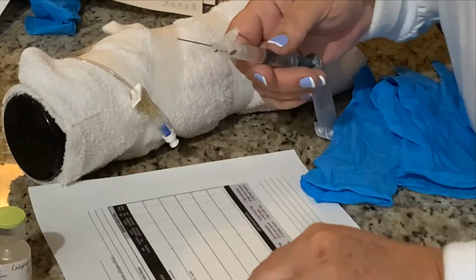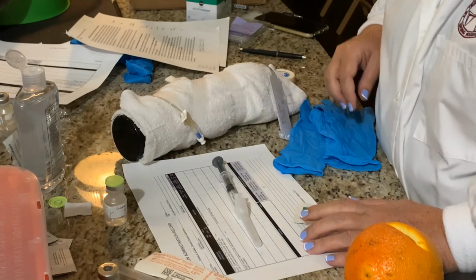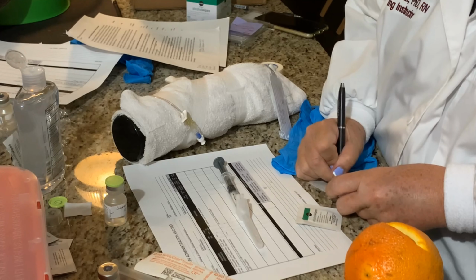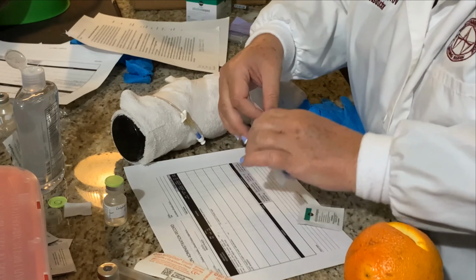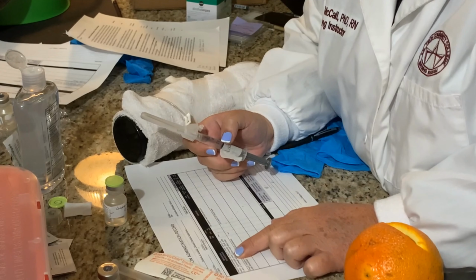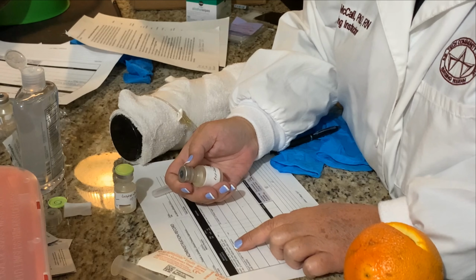Pull that out. Again, I'm going to do the one-handed scoop method. I don't want to contaminate anything. The next thing I'm going to do is I'm going to label my syringe. Always have to label your syringes. So I'm labeling that this is Lasix or furosemide, and it's 20 milligrams that I'm giving. Okay. And I'm doing my second check. Furosemide 20 milligrams IV push. I'm also making sure that I check the expiration date on my medication. Expires 2025.